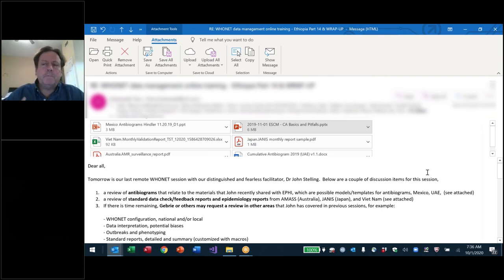The risk is, if you simply publish the numbers, you usually end up underestimating the disease because we are not taking cultures to a very large degree. You end up underestimating the disease incidence, but you often overestimate the resistance proportion, because when we do take cultures, it is often the sickest people: the treatment failures, the ICU patients, patients with complicated medical histories. In a biased data set, when you're only looking at treatment failures, you might find that in this non-representative database maybe 40% of the isolates are resistant to a particular antibiotic. But if you had a true unbiased sample, it might only be 10% resistance.